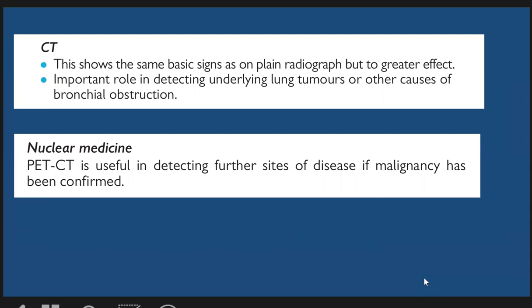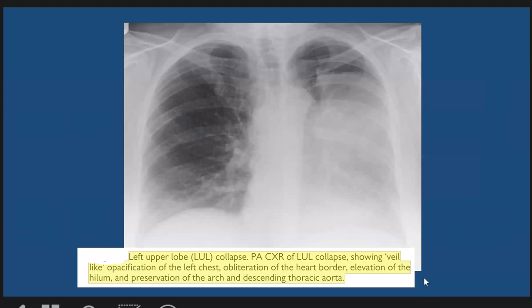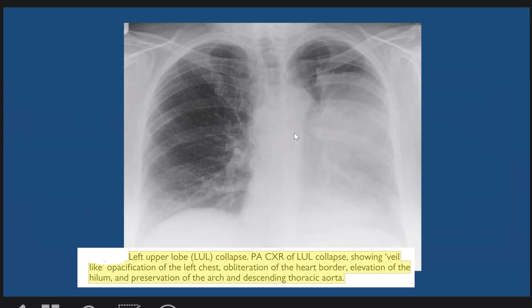Let us see some examples of lung collapse or atelactasis. Here we have a classic example of left upper lobe atelactasis. In this patient we see veiling of the left lung with opacification and obliteration of the left cardiac border, with elevation of the left hemidiaphragm and preserved outline of the aortic arch and descending aorta.